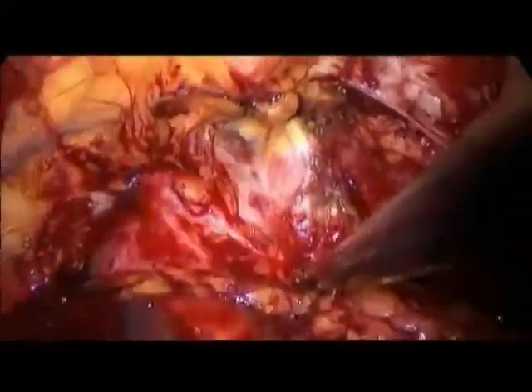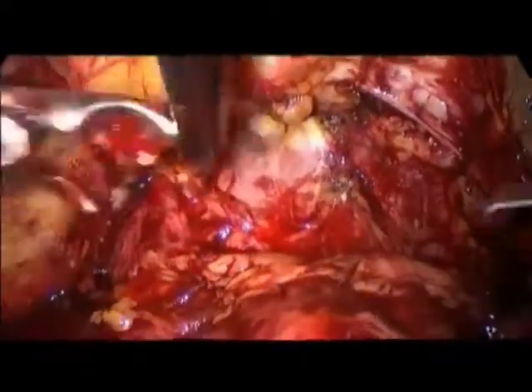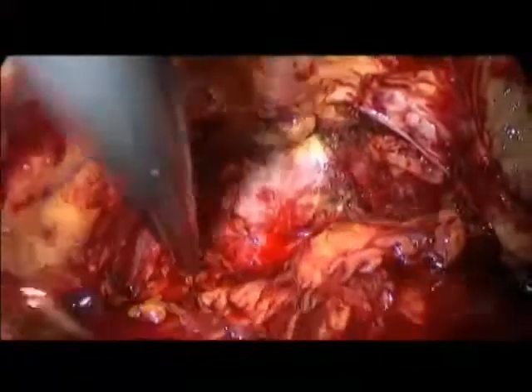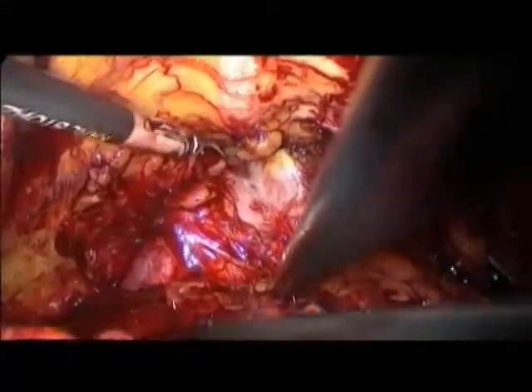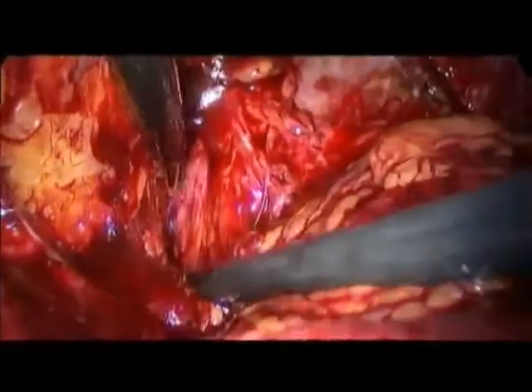So, actually, we have so far satisfying landmarks, maybe a little too much fat on this aspect. We have here something interesting which has to be shown and respected, which is probably an internal arterial branch running along the pubic bone, and you never know, it might be an accessory or even the main pudendal artery, so that it has to be respected carefully.